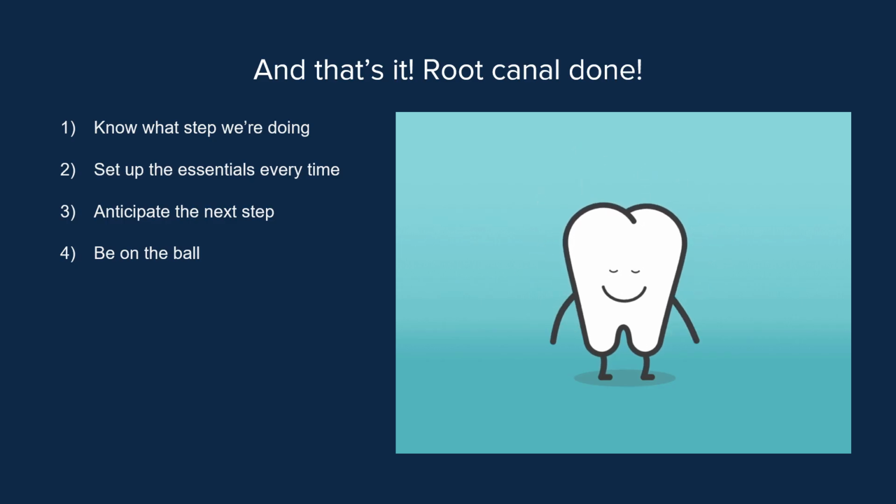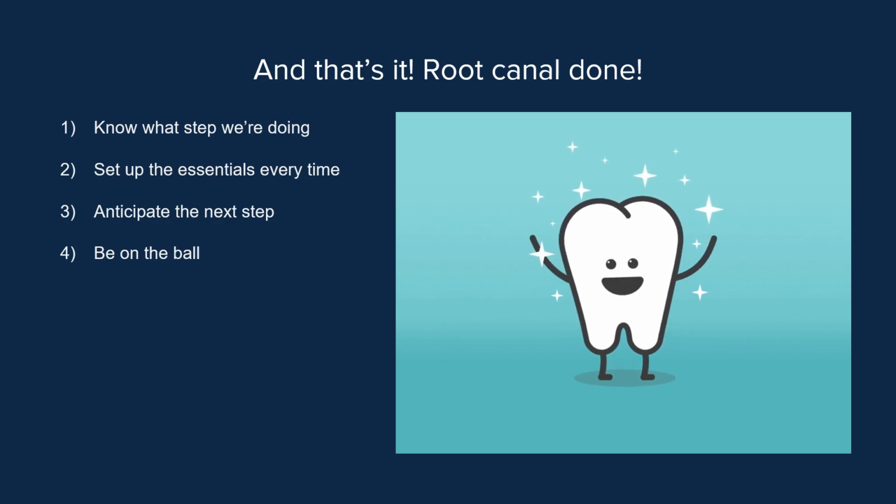And be on the ball. I've done many root canals, and I've seen many dental assistants just zone out and think about what they're about to do on the weekend. And if they were watching, they'd know I was up to the stage where now I need the paper points to tidy up the tooth. So be on the ball, be quick. The quicker you give things to the dentist, the quicker the dentist can do the procedure. The earlier you get to your lunch break, the earlier you get to your coffees.